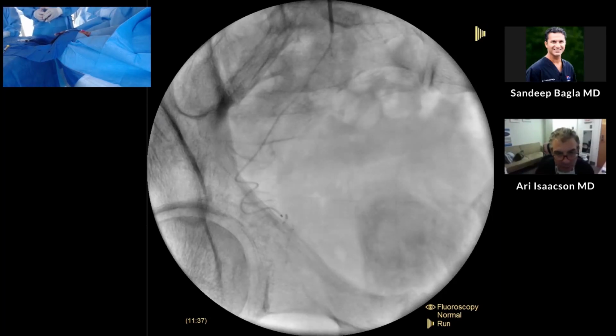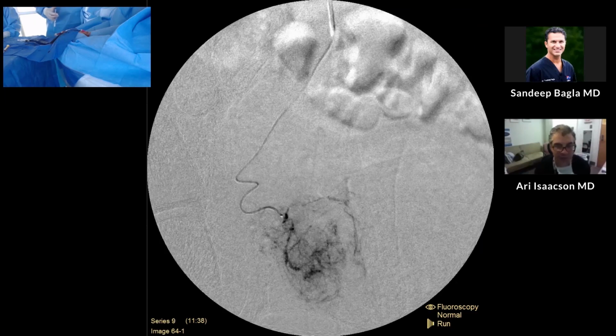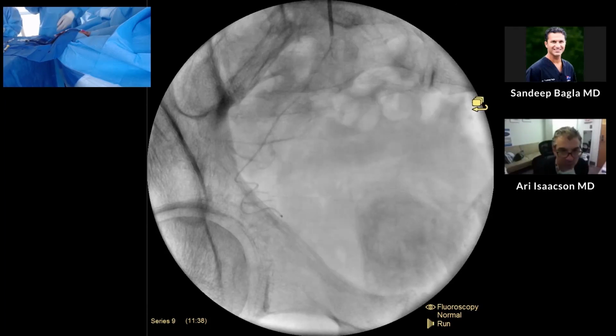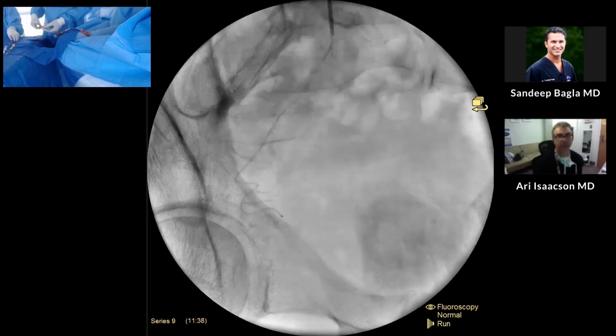Yeah, look at that. I just want to point out that stain that's still present on the contralateral side that you saw before subtraction. Even before subtraction, yeah, that's the reassurance that that stain is still present, hasn't washed out. It's a good sign that you've got really good stasis on that side of the prostate. Yeah. And I'm really happy also to see how distal this catheter tip is, right at the capsule of the gland. Great spot for Embo. Yeah, really great for Embo.